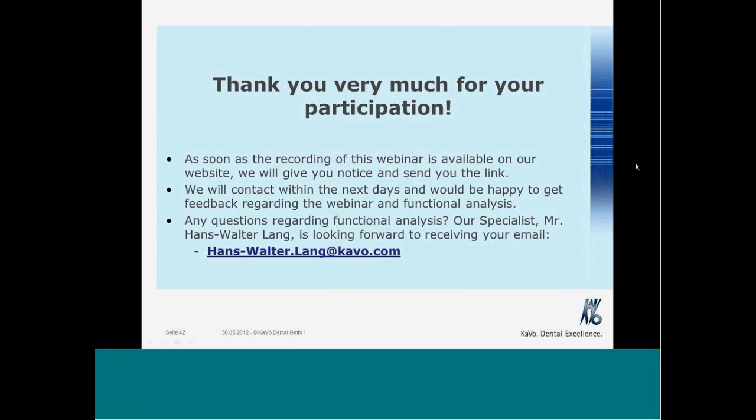Here, as I have shown to you, we do first the protrusive movement. From this, we can get the starting point of the movement. And I think that's the physiological position of the centric position. Then the next step is to fix these positions, for example, with hand guidance, first electronically.